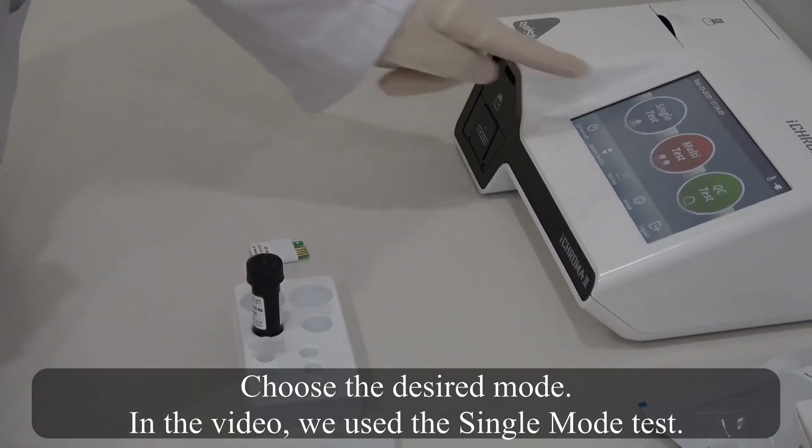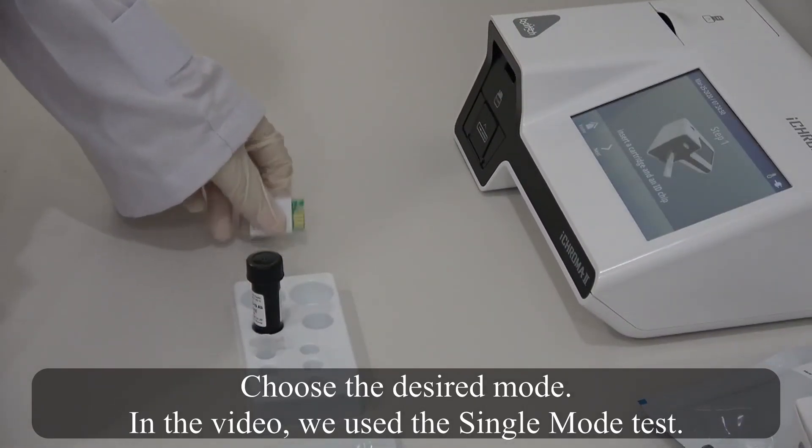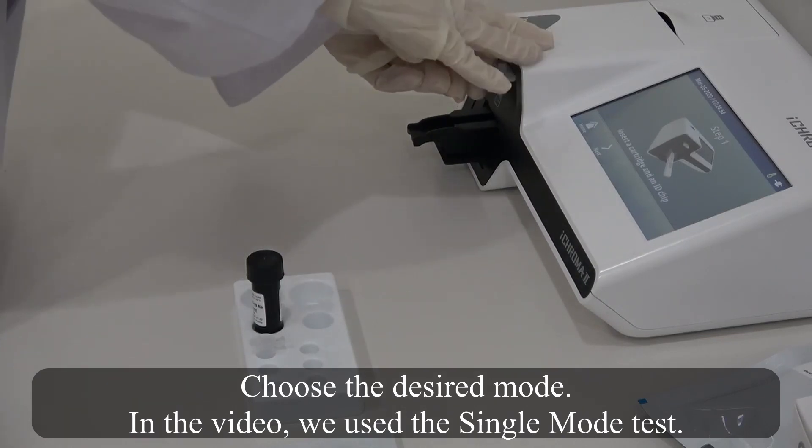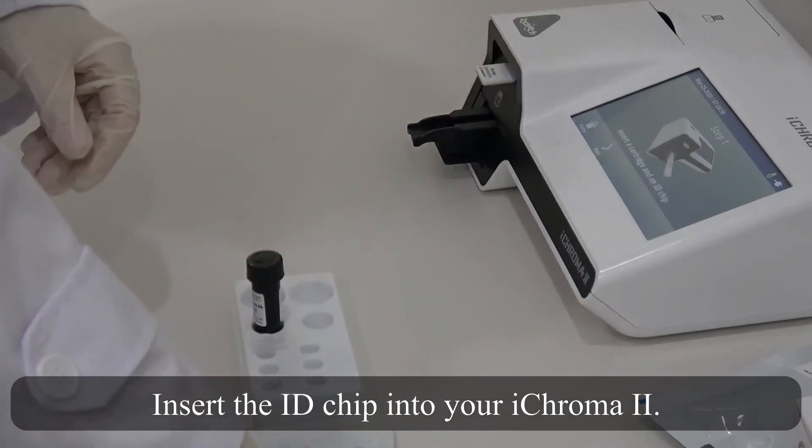Choose the desired mode. In the video, we use the single mode test. Insert the ID chip into your iChroma 2.